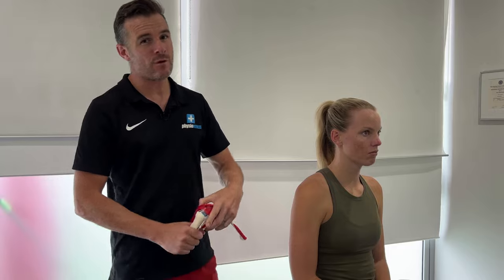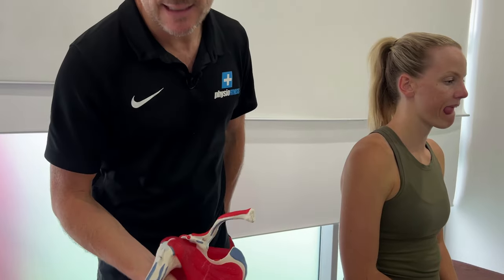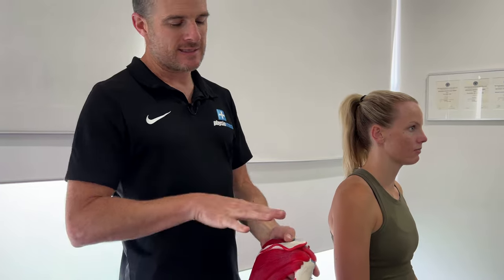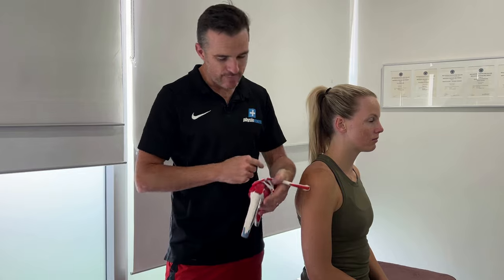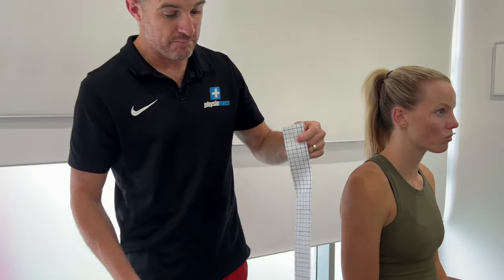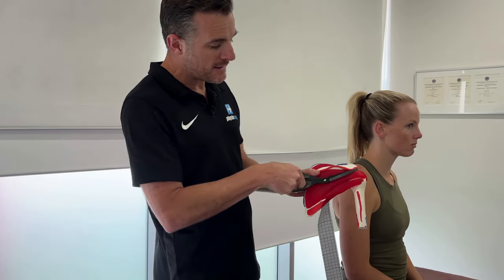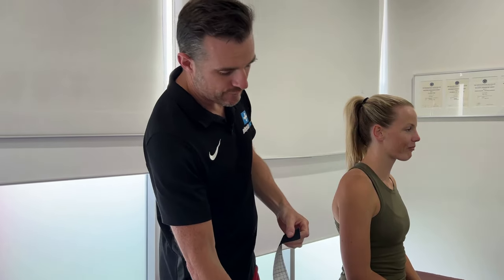I'm going to show you three rotator cuff tapings — not four. Of course there are four rotator cuff muscles, but we're not going to do the subscapularis because we can't get to it. The subscapularis sits on the inside of the shoulder, so you can't tape that. We'll tape the outside and top: the supraspinatus coming along the top, the infraspinatus, and the teres minor. With kinesio tape, you go down the length of the muscle fiber direction — that's the direction we follow.